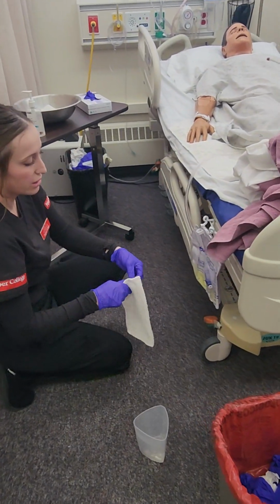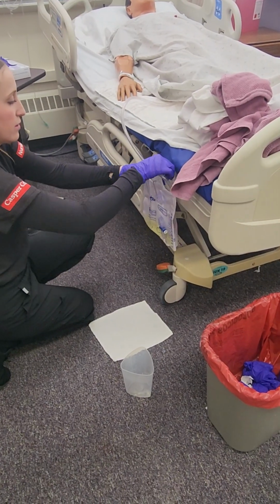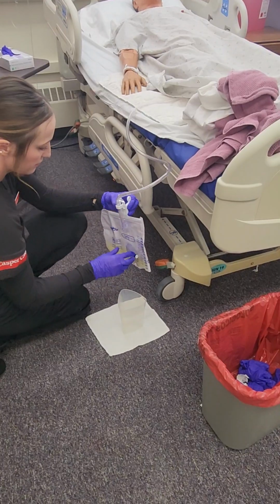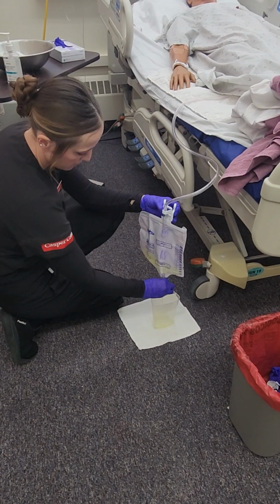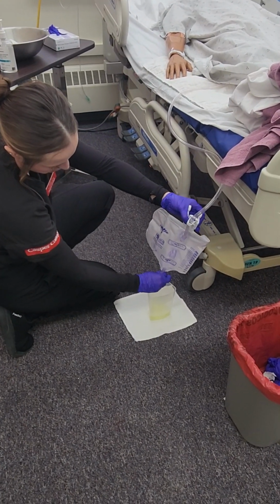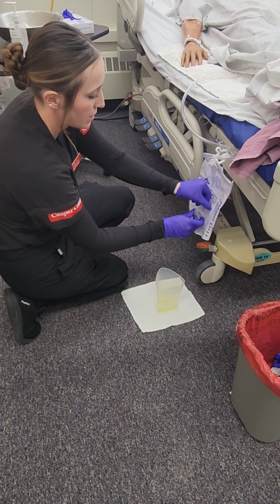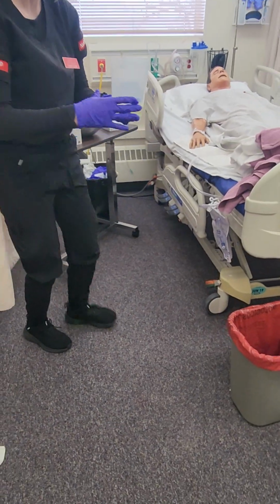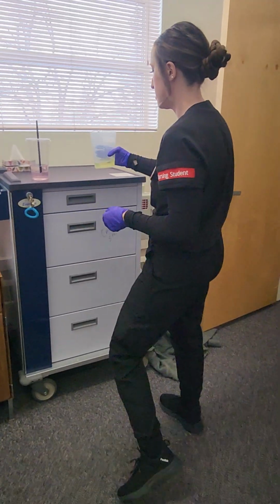And a paper towel. Make sure I got all the urine out of the line. Alright, put this in the laundry. I'm going to take this to his bathroom. He's still in the patient's room, just in his bathroom.